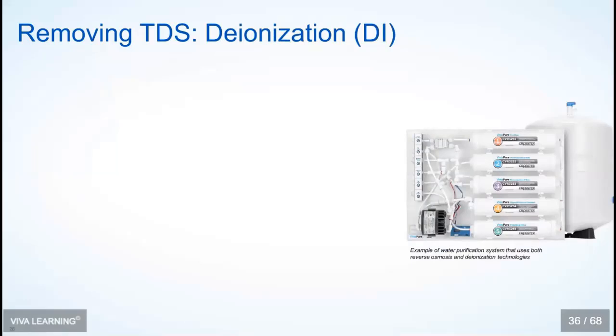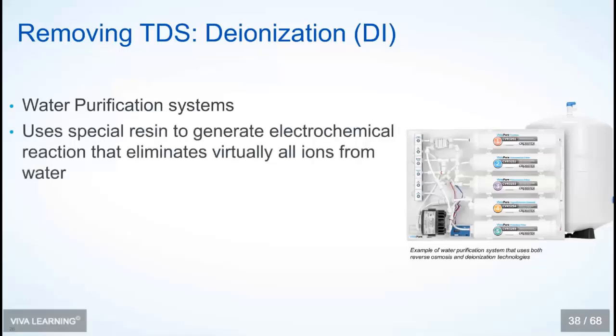So when we do deionization, deionization allows us to produce hyper-filtered water. It connects directly to the city water, and then it sends the water through a series of different deionizing and filter processes to produce water that can be used in your bottled water system for your dental unit water that you're using with patients, or it can also produce a different type of water, the low TDS water, that would be used in your sterilizer.